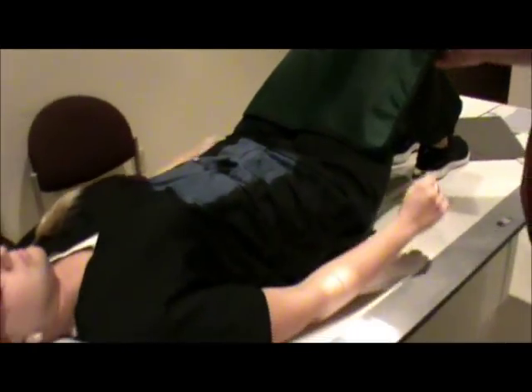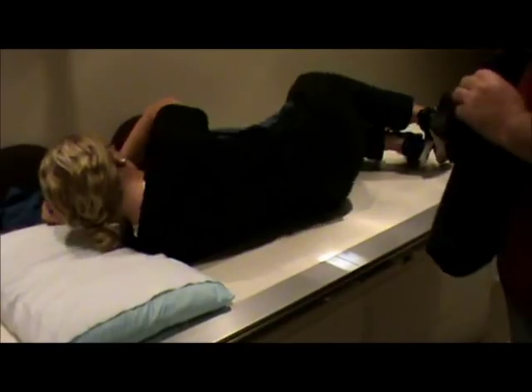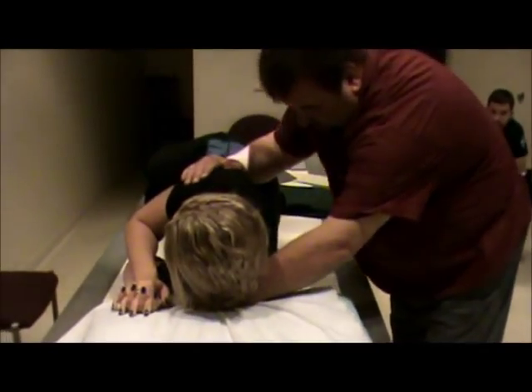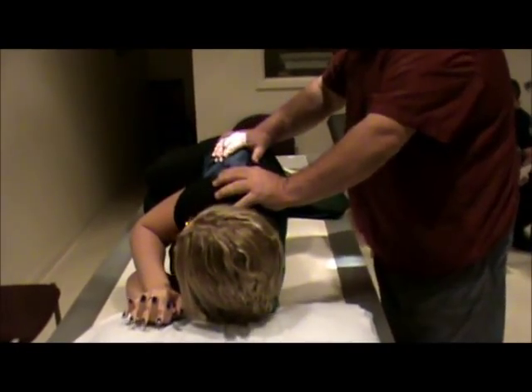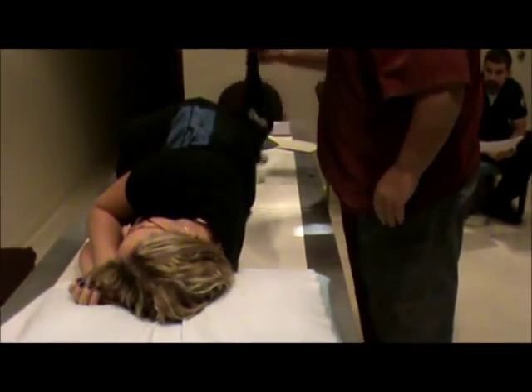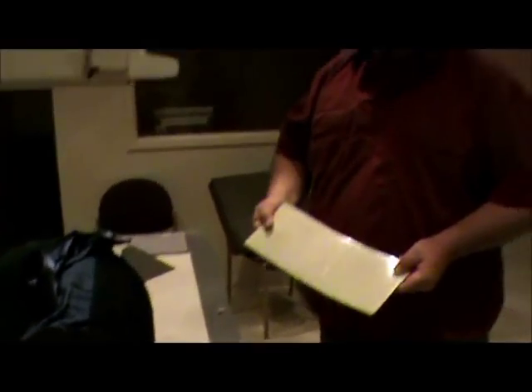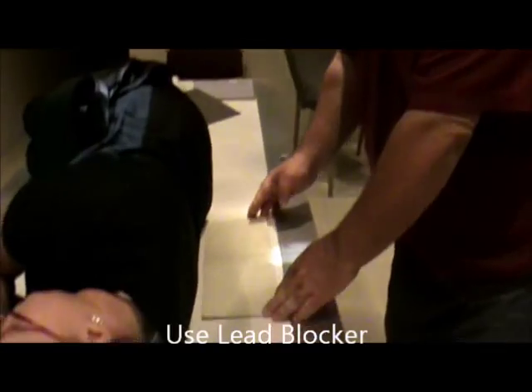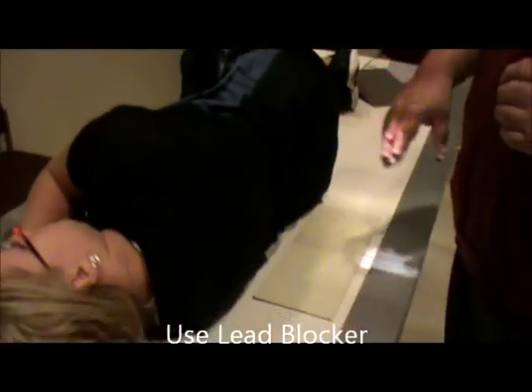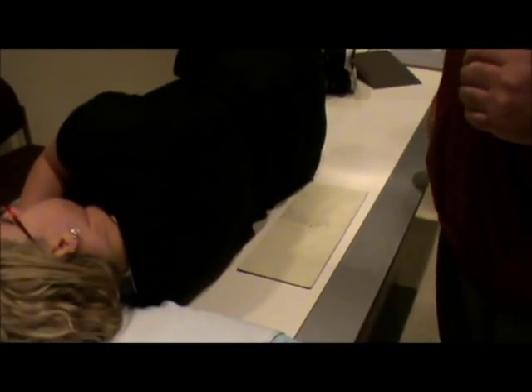We're going to have the patient roll onto their left side. We want to make sure that we get the patient straight — we're going to move the hips a little bit, and the shoulders are nice. We want to go ahead and shield anteriorly. We actually want to use a lead blocker — we're going to put that behind the back. That will help reduce the amount of scattered radiation and will actually reduce the film from being too gray.